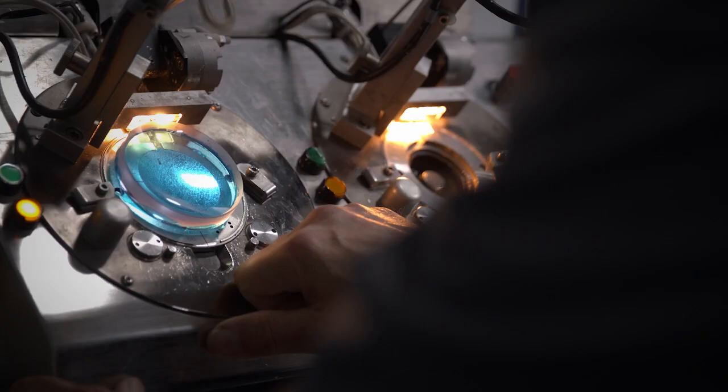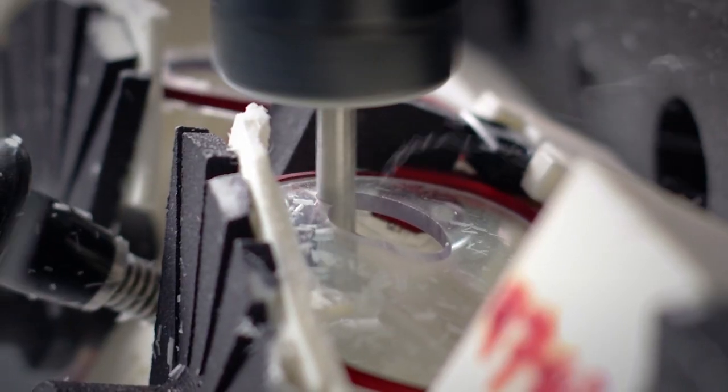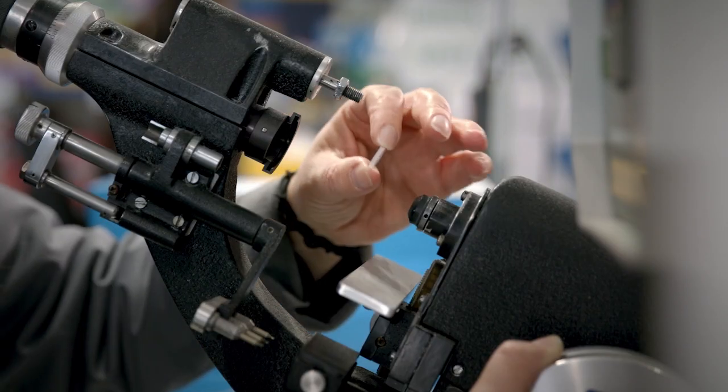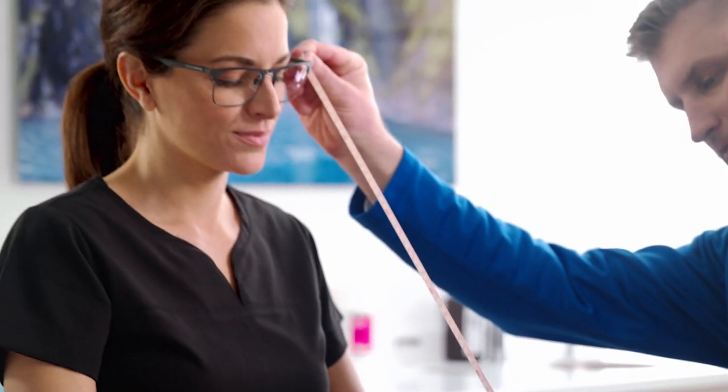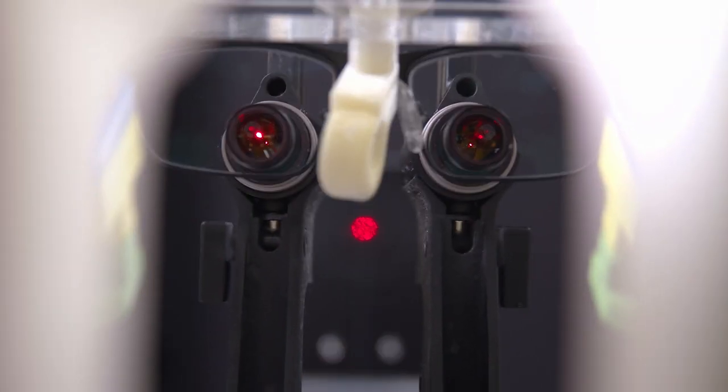The width of your head. The location of your pupils relative to the top of the frames. The distance between your pupils and the carrier lens. Your personal working distance. Every last detail is captured.